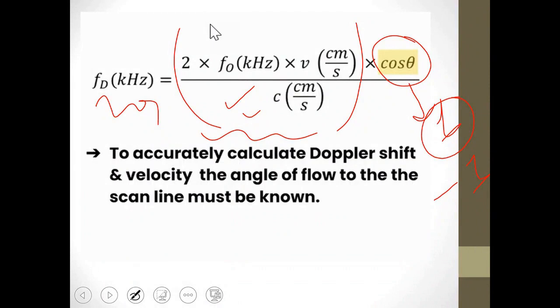Detect the direction and velocity accurately. Because if we assume you sent an ultrasound pulse and received it, and the shift in frequency was very weak and you couldn't detect it, what does that mean? It means that in this case, your accuracy in detecting your direction will be weak. This is related to these factors.